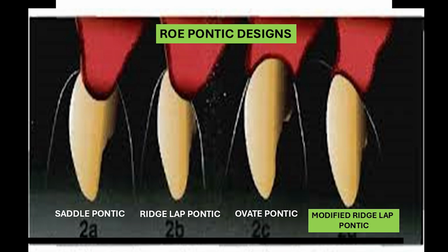This is ridge lap, where the facial extends to match the teeth on either side of it, but the lingual is a little open right here for hygiene. This contacts the ridge, this area. This is ovate Pontics, which we don't do very much of. We should do more in the anterior. Doctors don't like to do it, and I have a slide that will show you why.